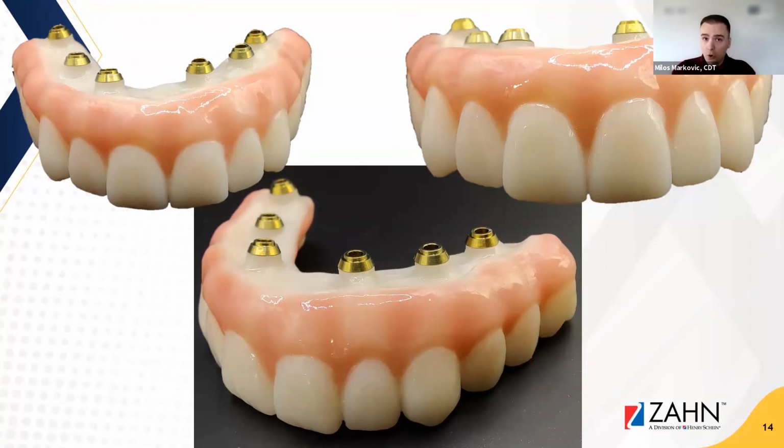For the cementation protocol, we used Multilink Hybrid Abutment cement and Monobond pre-treatment liquid on both the titanium base and the zirconia. The zirconia gets sandblasted very lightly at a very low PSI on the inside of the interface. The Ti base from DES actually comes pre-sandblasted, so we don't touch that. We just apply Monobond, and then we take the Multilink Hybrid Abutment, put them together on a nice, clean, steamed-off surface, and you're good to go. The restoration really lasted. It looks great.